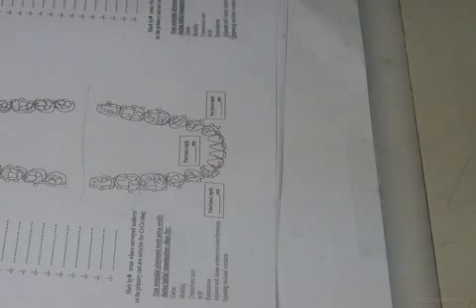Other than clinical examination, we also examine occlusion on abutment teeth, because we want to see if there are tight occlusion contacts. We could see it in the patient's mouth, or when we articulate the upper and lower cast, we can see them on the articulator. Wherever we have tight occlusion contacts, sometimes we prefer not to rest on that area, not to put a rest on it. So these are the findings. Other findings, the chart also includes them, not to forget them. Always take the functional depth. That's very important.